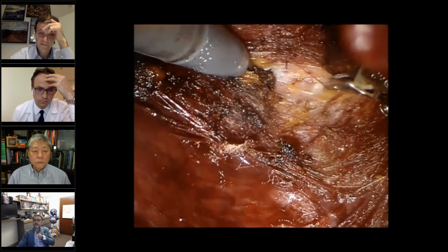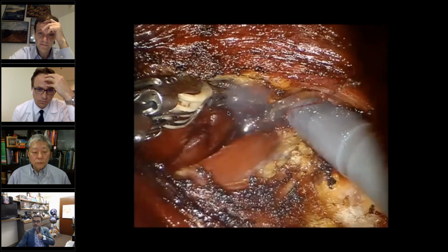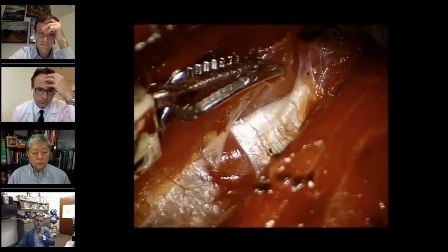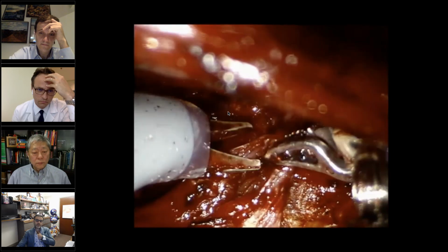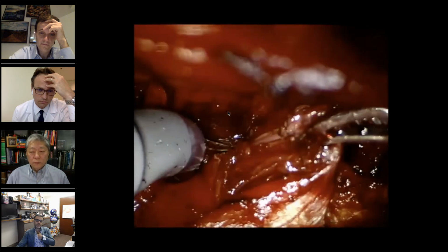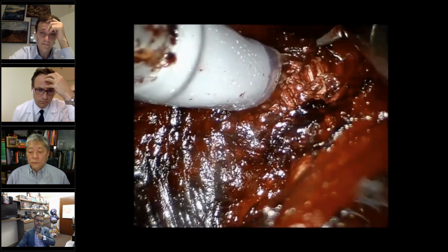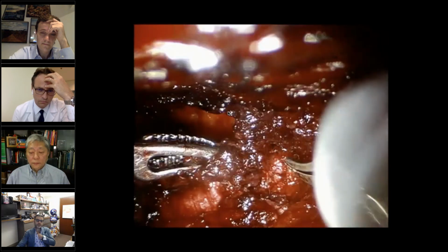And here's the section. Here's a subcutaneous dissection over the latissimus and the teres major. Here the teres major, here the latissimus fibers. As you can see, going under the triceps is a very sensitive part. Here we are cutting the teres major adhesions to the latissimus dorsi, and cutting the latissimus dorsi from its origin. The radial nerve is just below, and you have to take care.